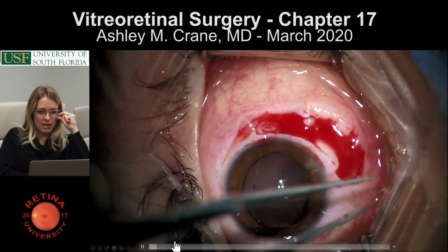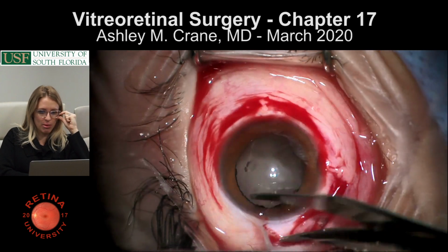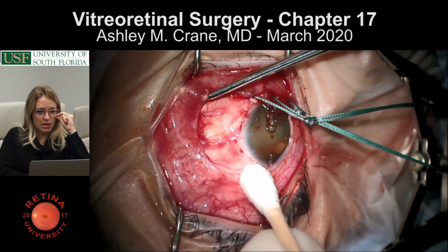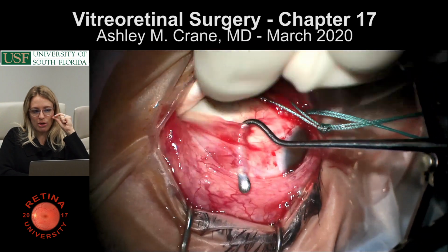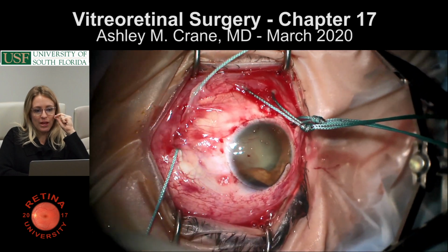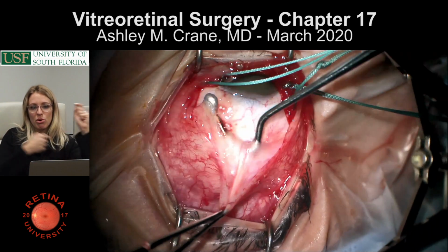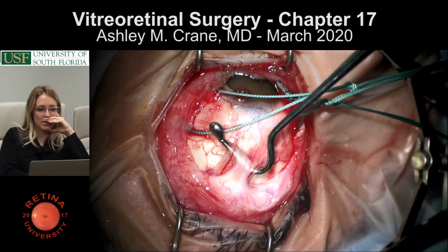So this, to me, looks like a young person. I can't remember this person exactly, but it looks like a young person maybe after trauma or something like that. You can see the Tenon's is really thick. That's why it looks like a young person. So basically, you're doing a 360-degree conjunctival peritomy. This is for an encircling buckle. There are other types of buckles. You're isolating the muscles. You're basically making loops around them so that you can pull the eye in different ways. This is the person who looks like trauma. You can see that they're missing some of their iris.